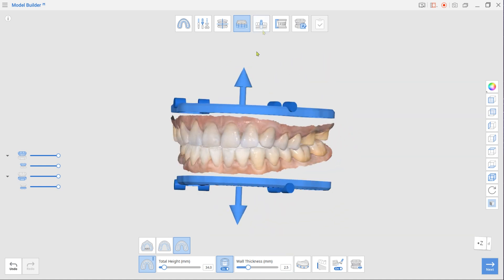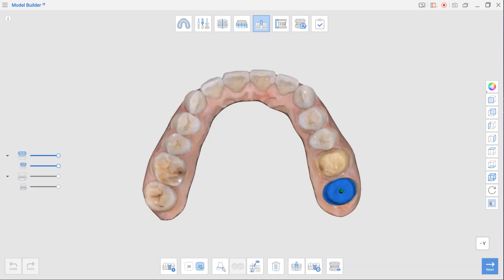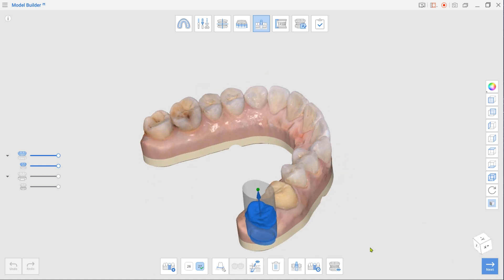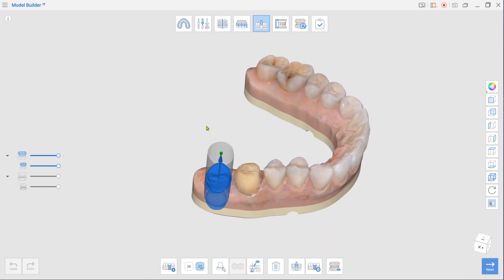When done, move to Die Creation mode. If you drew margins for the prepped teeth in MeditScan for Clinics, your dies would be created automatically.